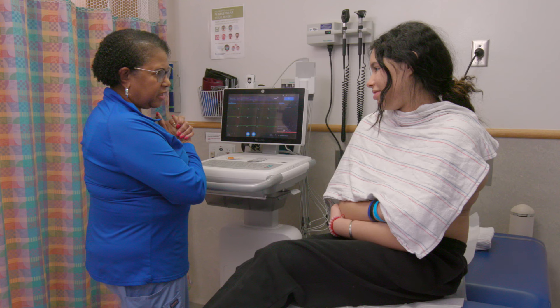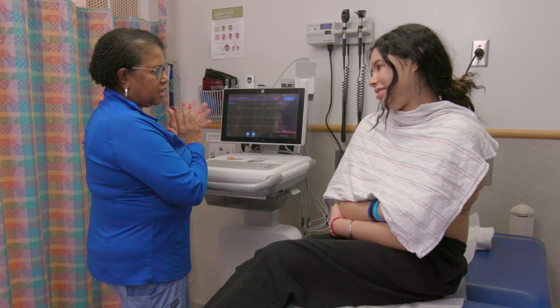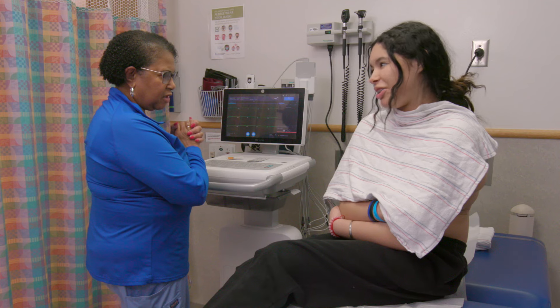My name's Penny, so I'm going to do your EKG today. Have you ever had an electrocardiogram? It takes a recording of your heartbeats. And we have any questions for you. Does it hurt?